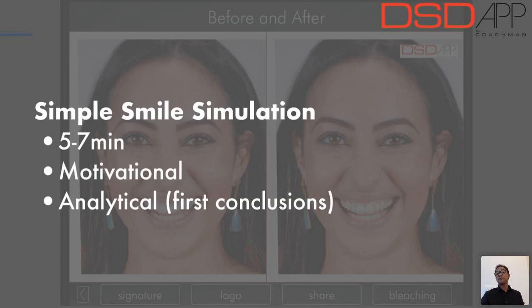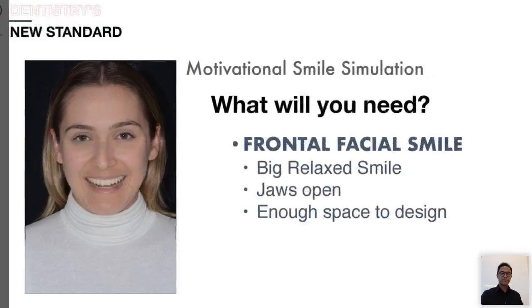And it becomes motivational because the patient now sees not only that smile, but a harmonic smile that is analyzed by the facial structure. And you can also get the first conclusions of what the patient wants, and not just what you want, but what the patient wants. So you have that communication, that engagement with the patient.